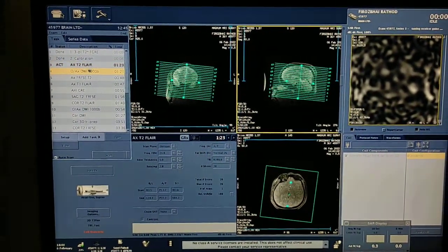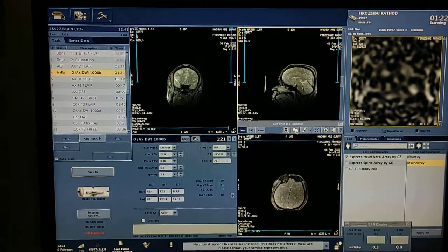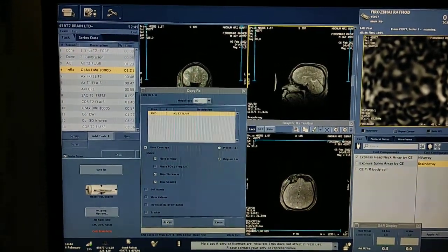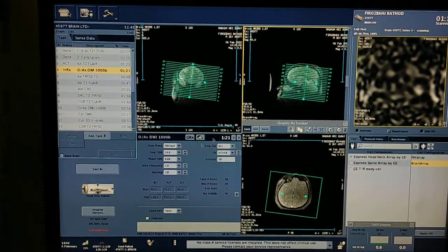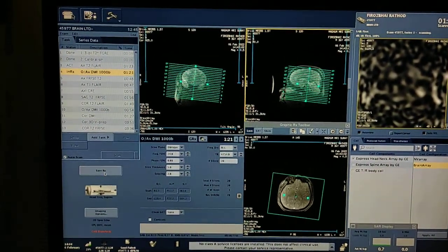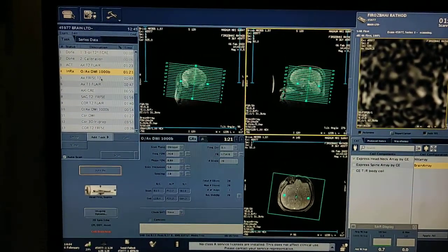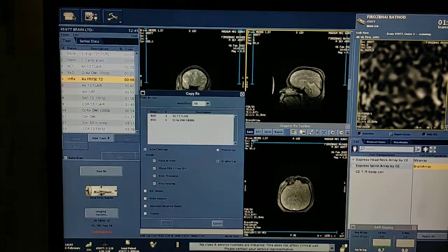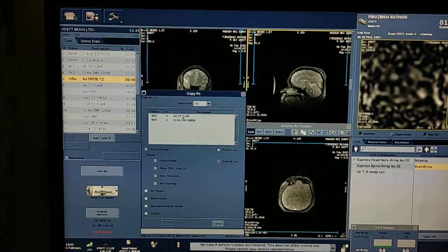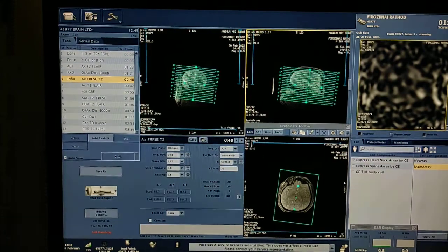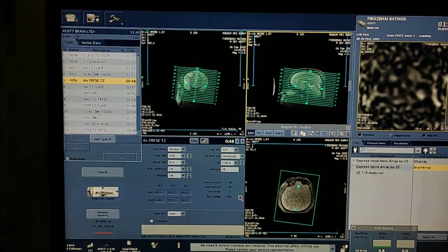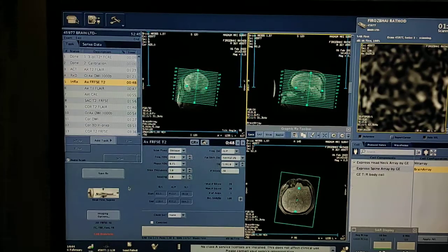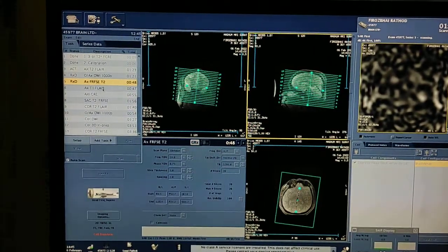For diffusion: double click, open, click on the RX box, select accept, copy all sequences one by one, save RX. For T2: double click, open, click on the RX box, select — copy all axial over axial, coronal over coronal, and sagittal over sagittal.